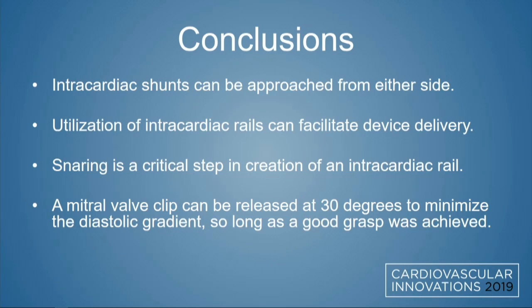So this is just an example where you can actually snare the catheter instead of the rail. And lastly, you can open a MitraClip to 30 degrees to try to minimize your transmitral gradient as long as you've got a good grasp and you're confident in your grasp.